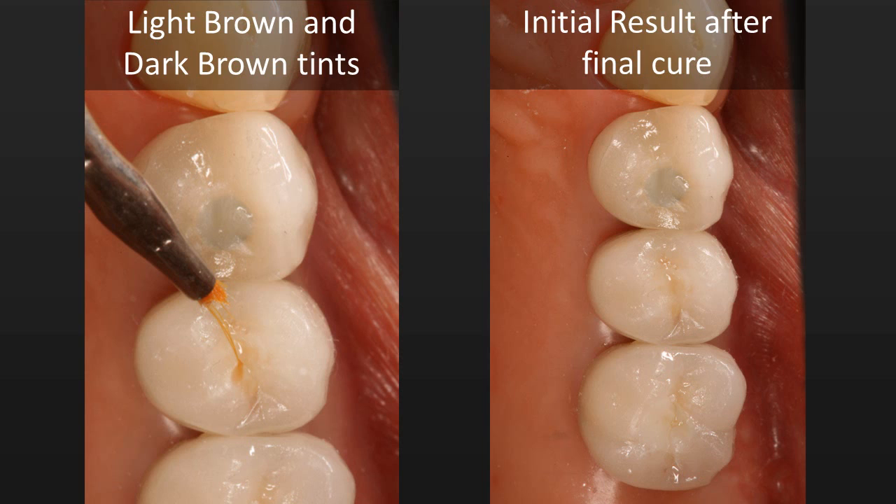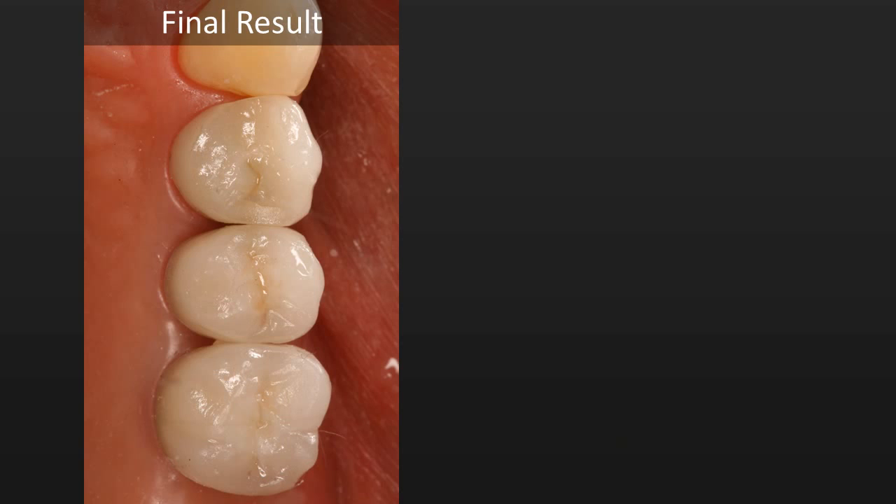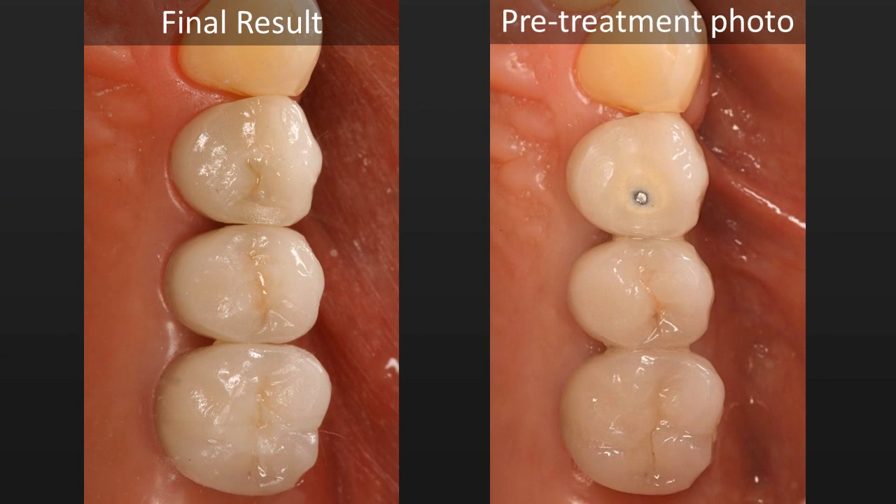Looking at the photograph, the seal for the first bicuspid is looking kind of gray. So I actually went back, re-prepped that area, re-opaqued it, and re-layered my nanocomposite and tints. I think we got a better outcome on that second go around. Looking at the preoperative image, you can see the adjustment of the porcelain through to the metal on the first bicuspid, and in the final images you can see the improved result.